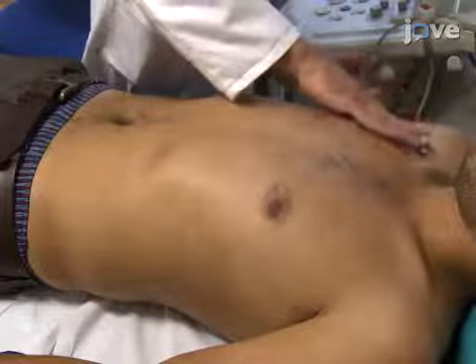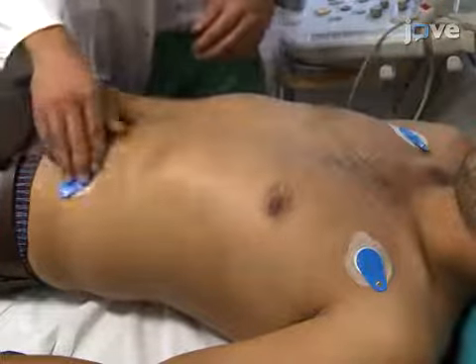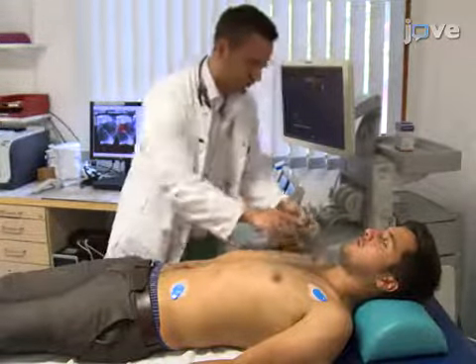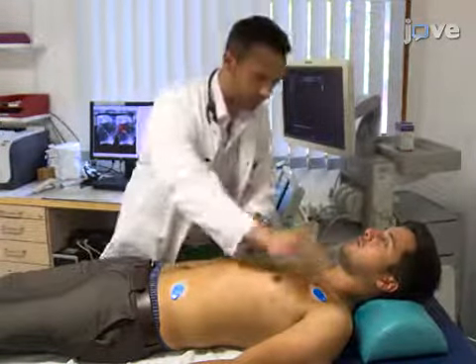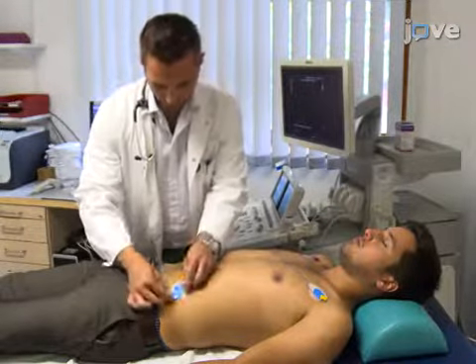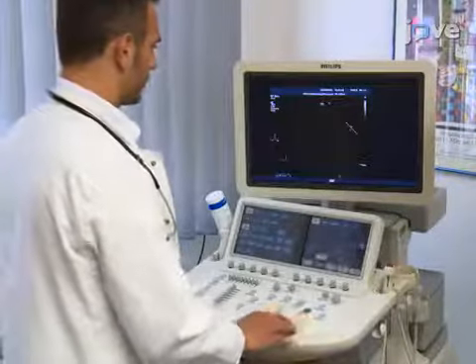Escort the subject into the testing room and connect them to a standard 3-lead electrocardiogram, or EKG. Then plug the EKG wires directly into the echocardiography device in order to synchronize echocardiographic motion images to electromechanical activity. Unfreeze the ultrasound image to start detecting the EKG signal.